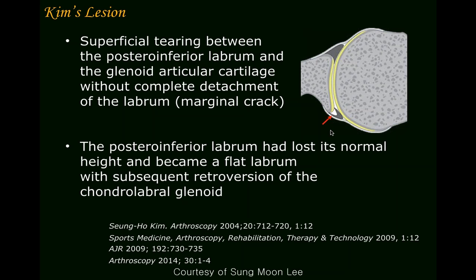Basically, it's a posterior dislocation with calcification. I had forgotten that he originally described it as a triceps avulsion. Correct. Orthopedic residents and so on, I'm not sure they're going to be calling this Bennett. Eventually, the names kind of go away.